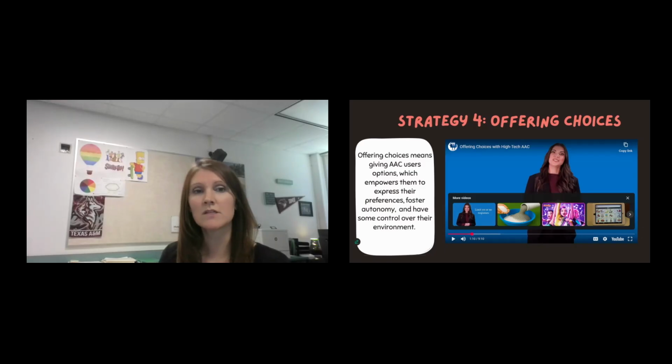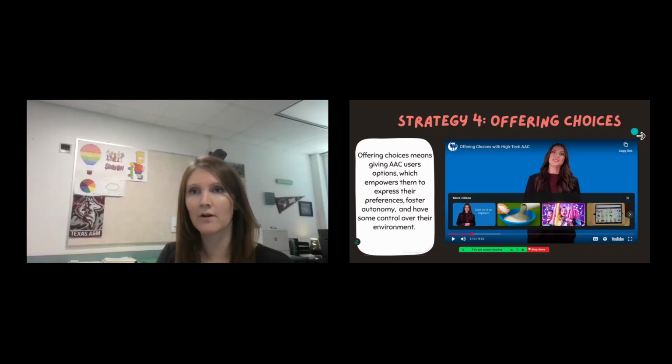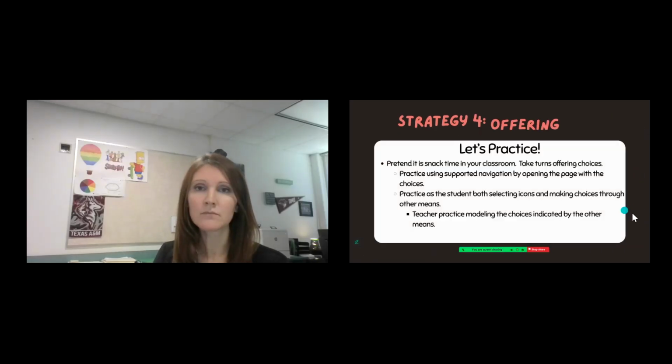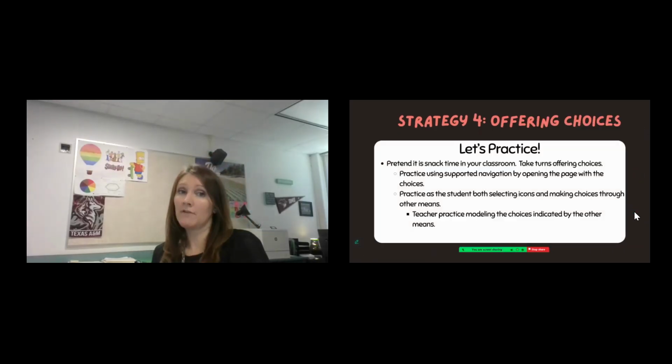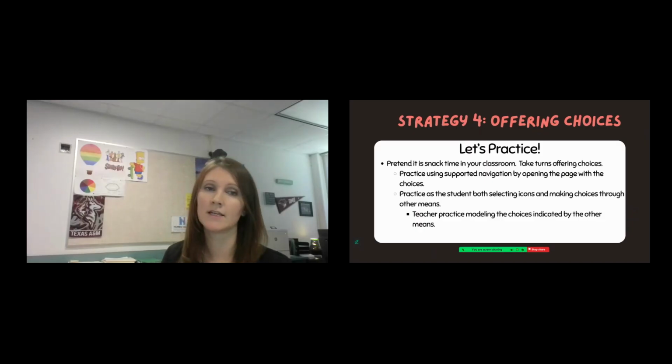So just giving students as much agency as we can, knowing that there are times throughout their day where we need to either keep them safe or keep them on track, but as much as you can, give them some control over their environment. So again, whatever tools you have in your classroom, if you want to use the paperboard, if you have access to a robust high-tech device, you can practice on that. But this is a big one where people make choices.